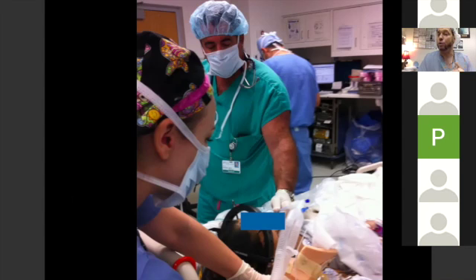So you say in your notes, because it's all about documentation, topicalization, sedation, awake fiberoptic intubation, patient moved four extremities prior to induction of anesthesia. And so that way you show that there was no injury during your intubation, because there can be injury during position. It always bewilders me when we're so careful with the cervical spine for intubation, and then the surgeon comes in, puts a shoulder roll under, drops the head in extreme extension, tapes the shoulders down.